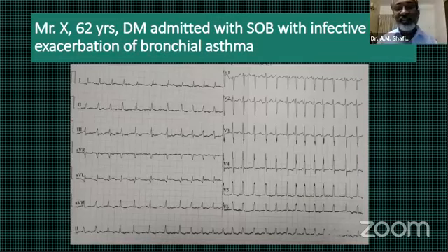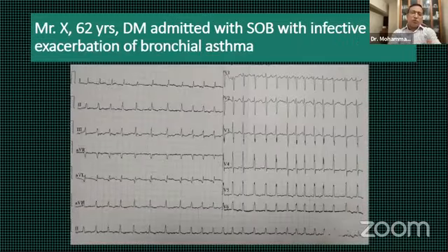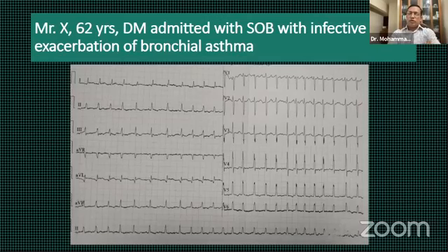Can I go for the next ECG, sir? Shofik bhai, if it was a case of lateral MI with atrial fibrillation, what would be the appearance of the aVR? If it is a lateral MI, then the lateral leads should be MI-like, and with this atrial fibrillation the aVR is supposed to be negative. So having a positive aVR with this appearance should bring in the suspicion that it could be an abnormal placement of the lead. Right.